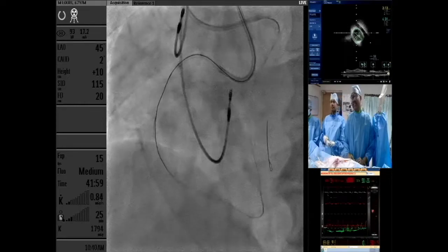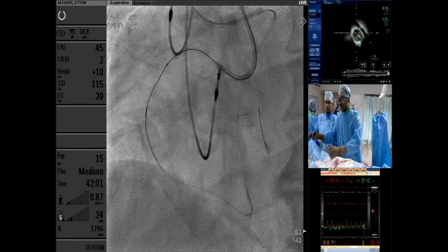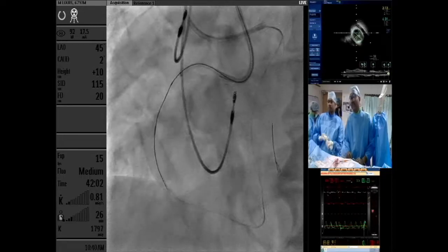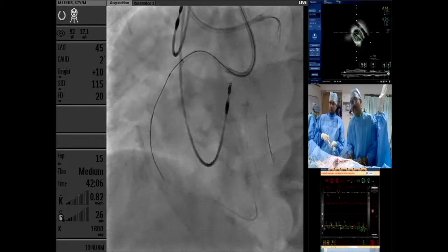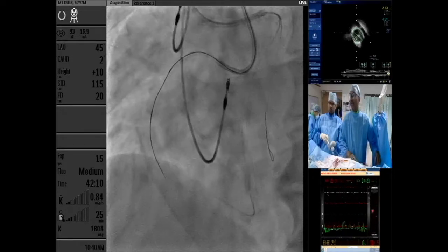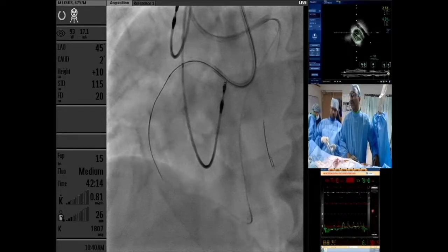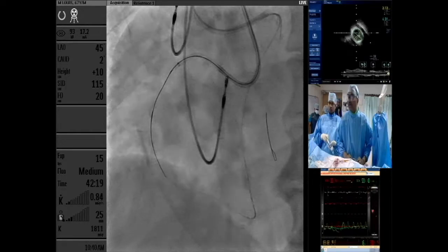38. Yeah. Don't have retrograde wire. Give me retrograde wire. Yeah, negative. Okay.